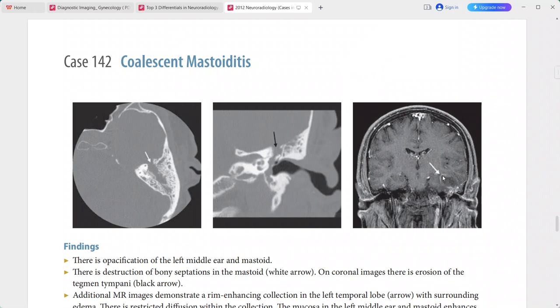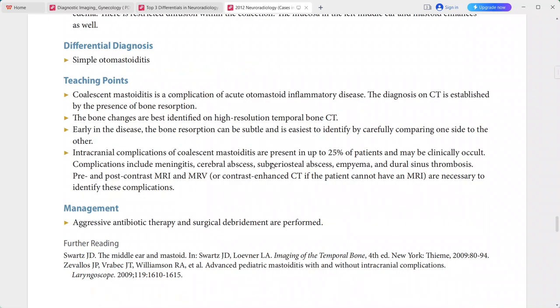Additional MRI images demonstrate a rim-enhancing collection in the left temporal lobe with surrounding edema and restricted diffusion within the collection. The mucosa in the left middle ear and mastoid is enhancing. This is a case of coalescent mastoiditis. Differentials include simple otomastoiditis.